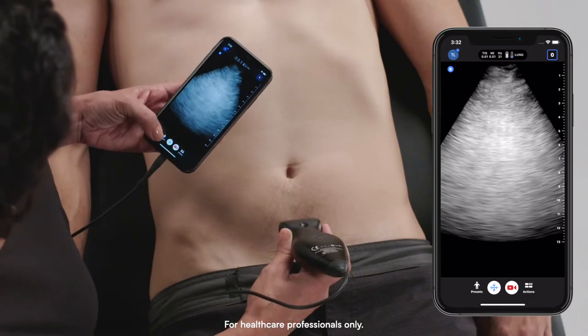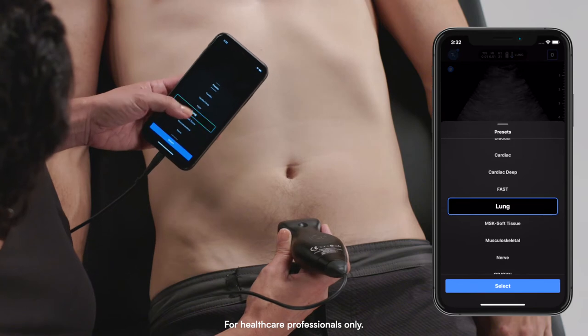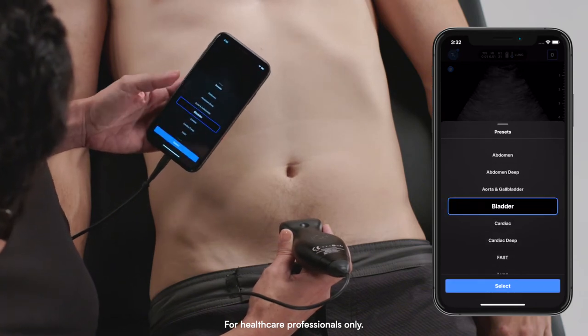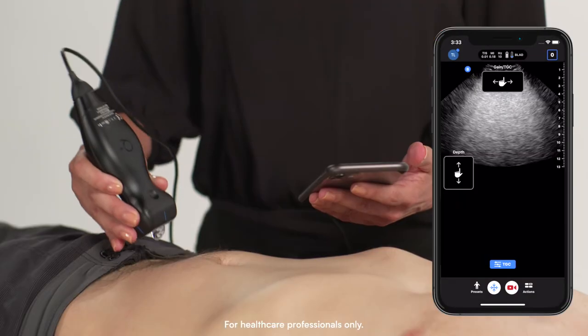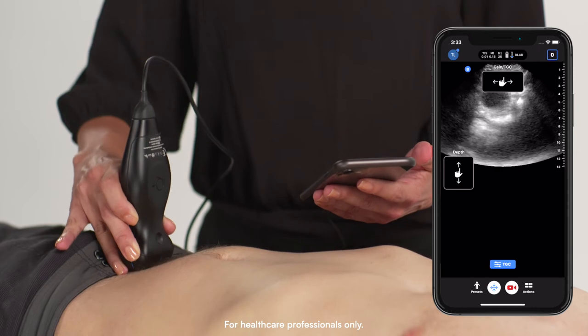To begin, I'll select the Bladder Preset, and I'm going to place my probe right above my model's pubic symphysis.